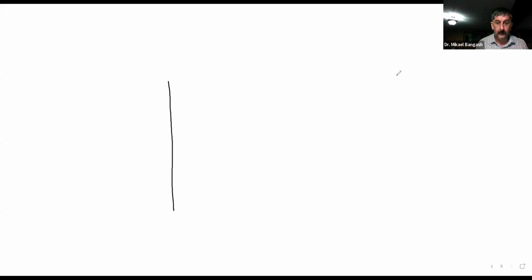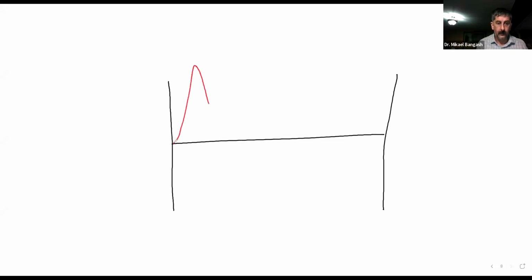Or if you just look at it, we had a positive Doppler shift with this, in the negative. Or on the other hand, we could say we have had a negative Doppler shift, where this would have been a positive Doppler shift. But this small spike here and this small spike here are your flow reversals.